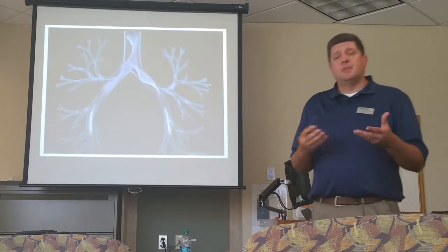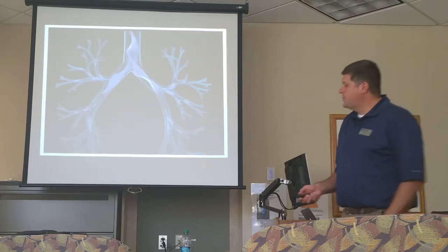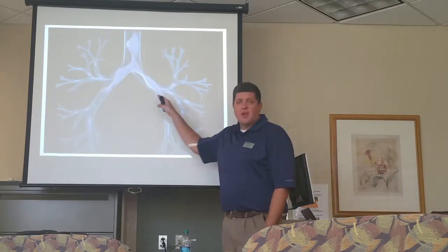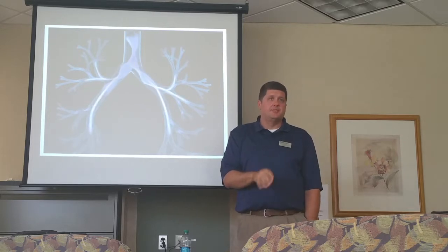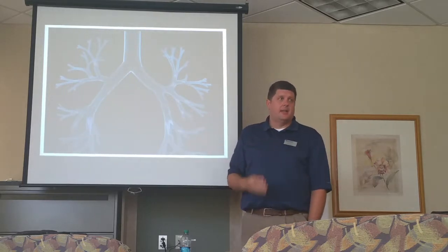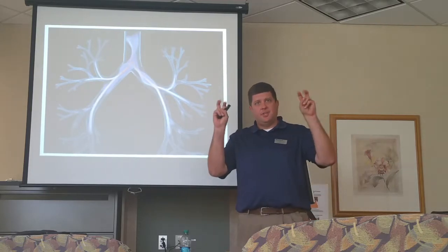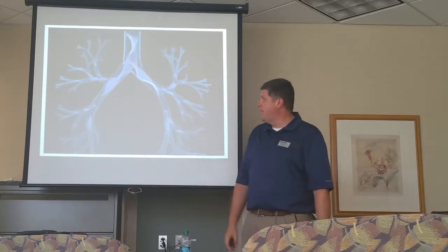Very small volumes delivered very quickly. It creates flow streaming, okay? And so the flow streaming penetrates through the middle of the airways. It penetrates through the middle of the dead space. It doesn't have to necessarily push all the dead space out of the way, like pretty much all other ventilators do. And so that's what creates the jet streams.